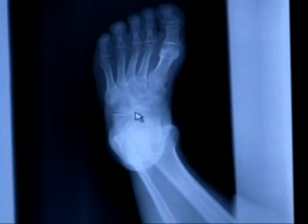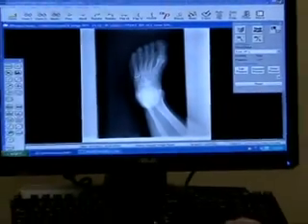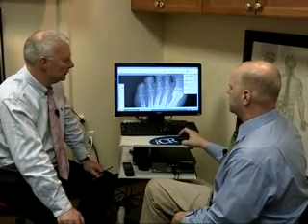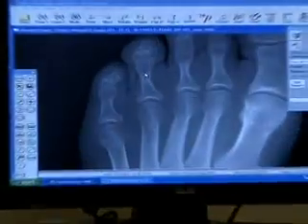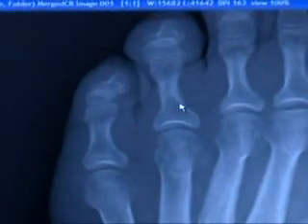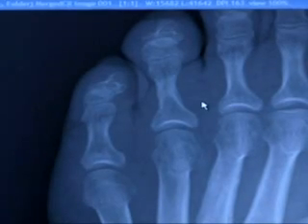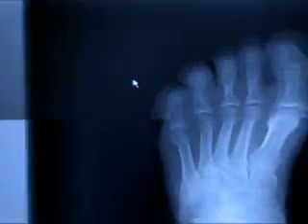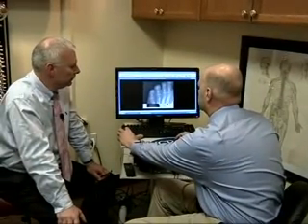So before, we would say, okay, well, let's come back in maybe 4 more weeks, or let's evaluate it, or send you for an MRI because we couldn't see it. But now we can go all the way up and magnify, and at this area we can actually see a fracture in this toe. The line comes up here and comes down here, which we would never ever be able to see before. If we invert it, it helps us look at that little whitening line in here too. So in the past, this would be basically an undetectable type of fracture in a toe. So we're able to examine that, look at that. We can magnify it. Even if we magnify it here, you can actually see it a little bit better here.